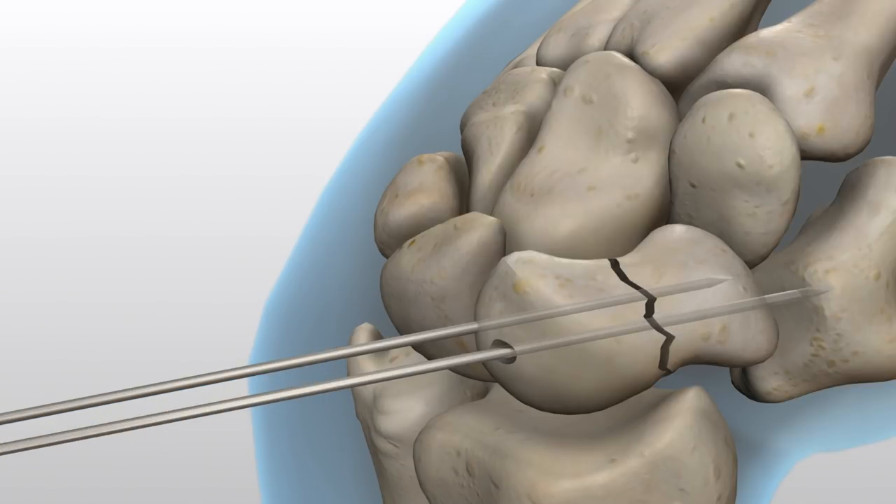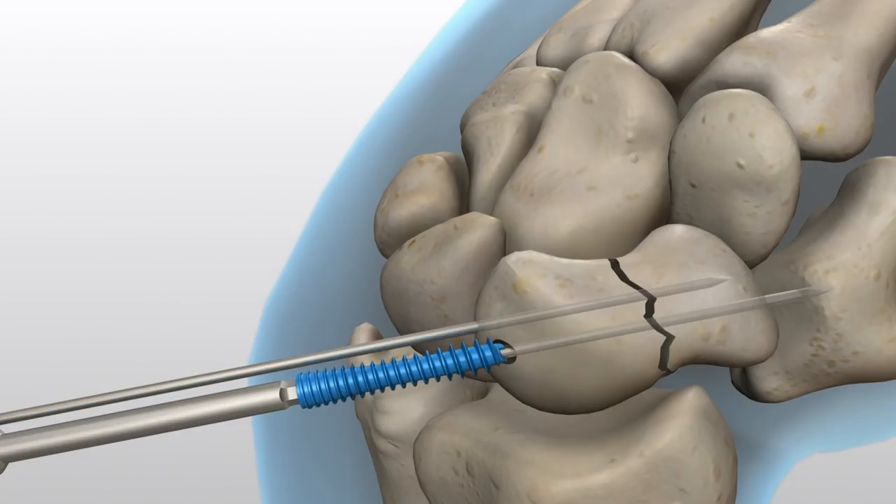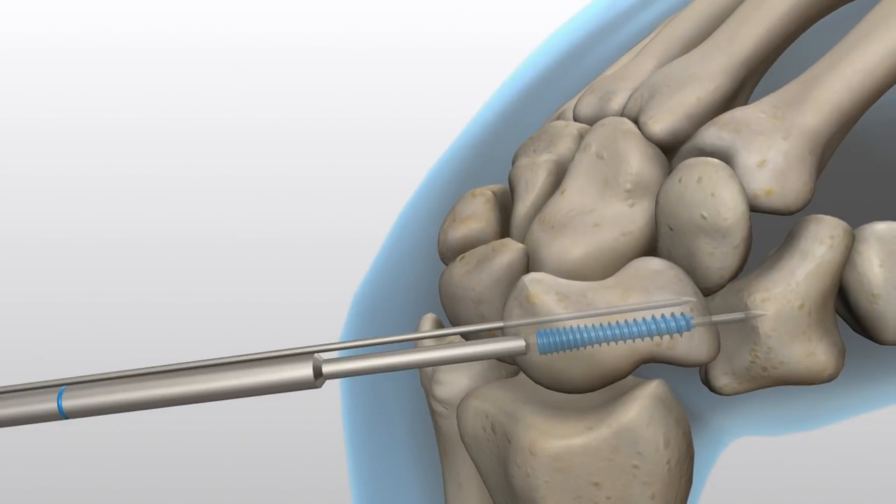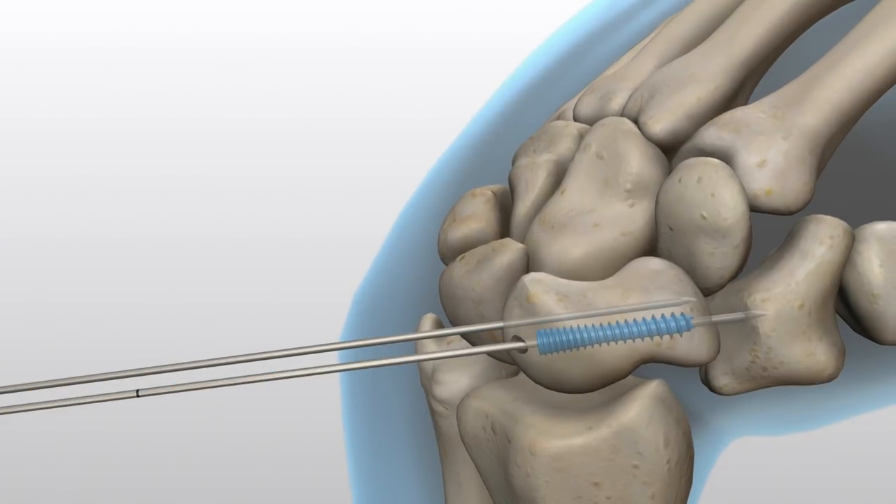Insert the proper screw with the blue-banded 2-millimeter hex driver tip. If resistance is met upon insertion or distraction occurs, stop, remove the screw, drill with the long drill, and reinsert the screw. Dense bone may require using the long drill and possibly downsizing screw length.